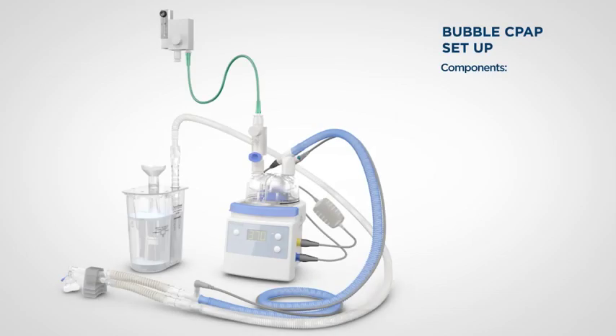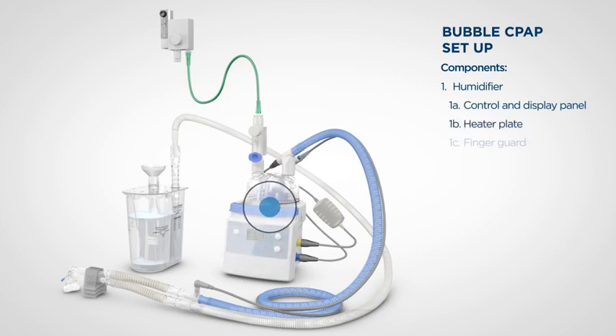Let's start by identifying the components of the F&P Bubble CPAP delivery system. This is the humidifier. It has a control and display panel at the front, a heater plate and finger guard on top, and colour-coded sockets to connect electrical adapters and sensing probes on the side.